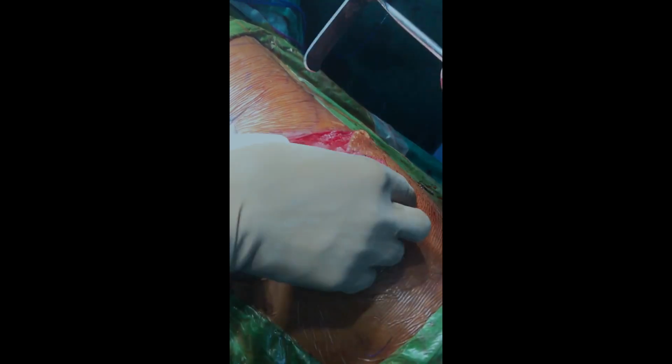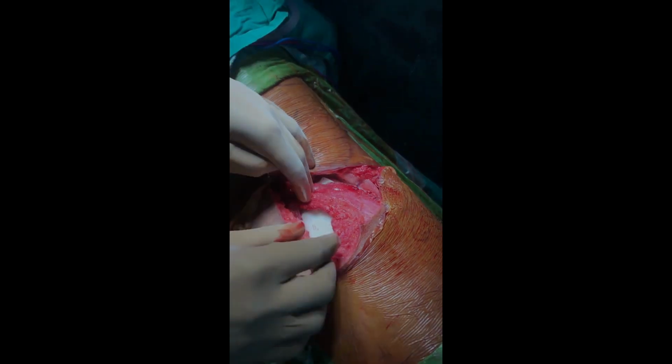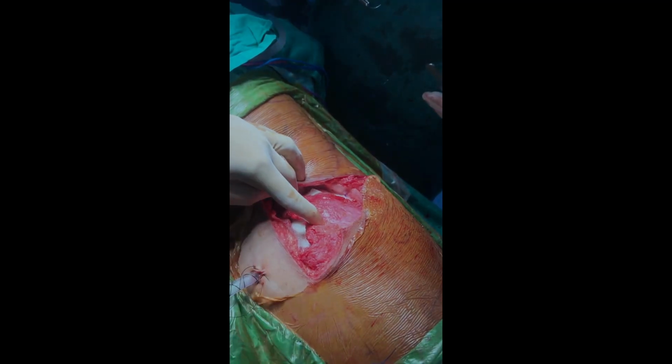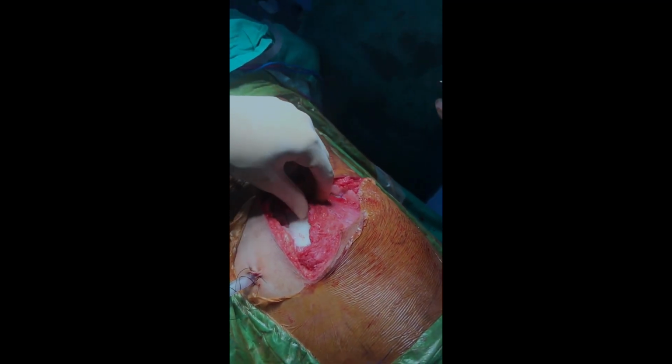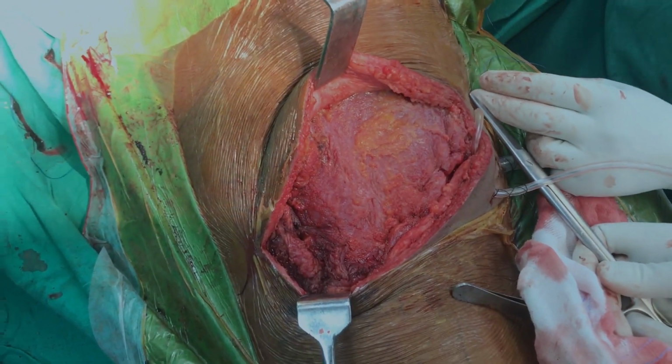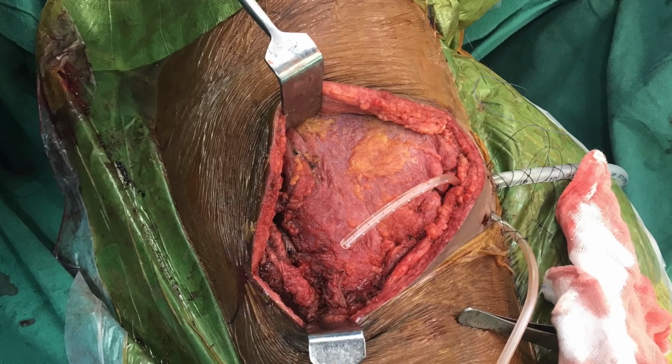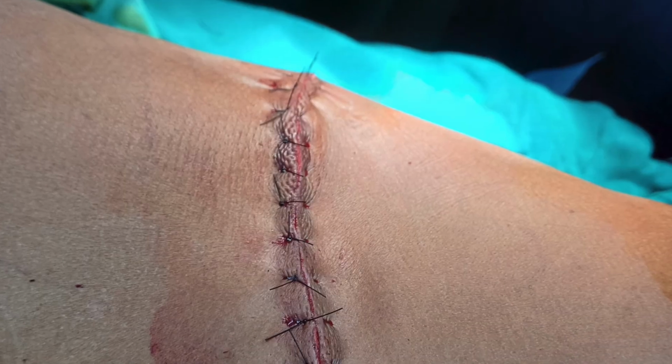The LD muscle is placed over the Prolene mesh and sutured in place. We closed the wound over an intercostal drain and a subcutaneous vac drain as well.